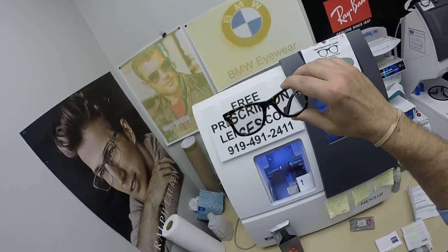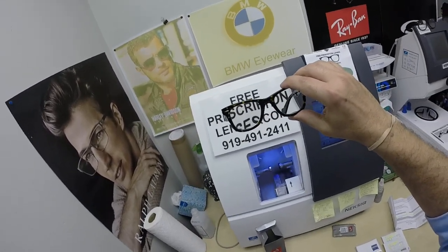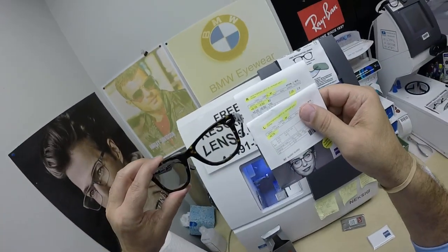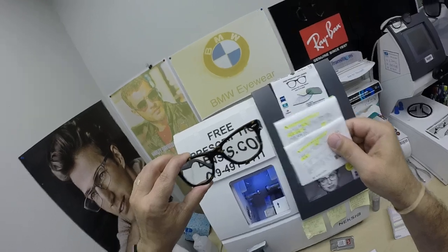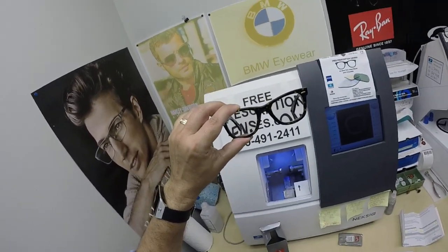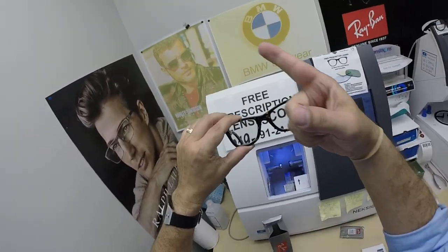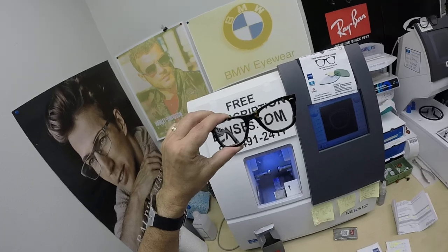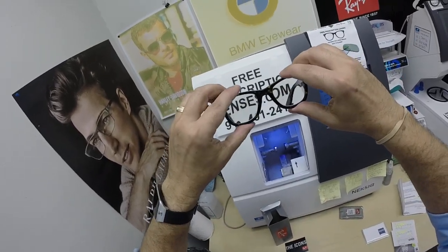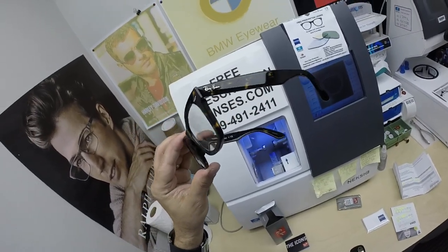Richard, thanks again for the purchase of the Ray-Ban 2140 Original Wayfarer, size 50, color 902, with your Zeiss Light D Digital Freeform Progressive lenses with the Photofusion Pioneer Green and the Premium DuraVision Platinum Anti-Glare Coating. Click on the link above to go to the website. Hopefully everyone has got a chance to see how fast these turn back to clear and to see how it brings that love and feeling back to glasses. Thank you.